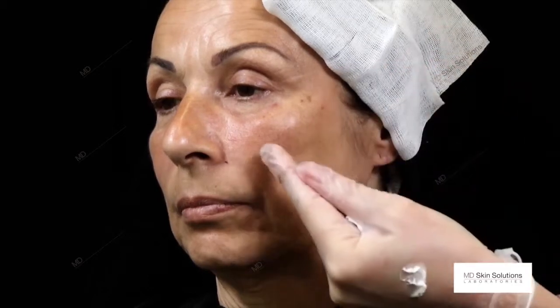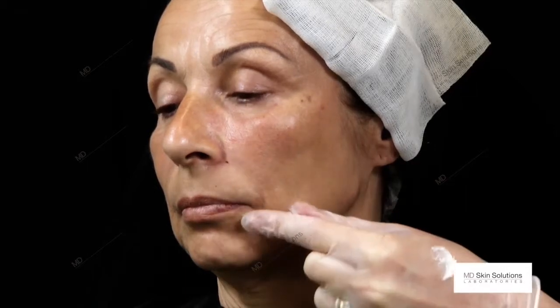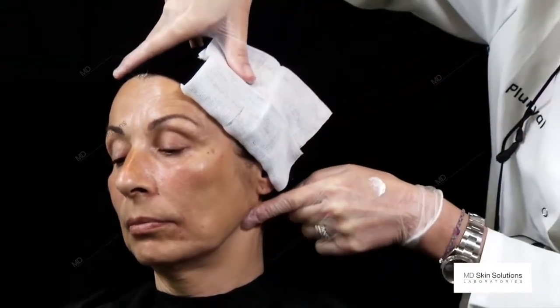Rejuvenate this lady's face by giving her a lateral lift, more of a frontal projection, a raising of the shade in the alar groove, redefinition of the corner of the mouth, smoothing out of the prejowl sulcus, and strengthening of the jawline.